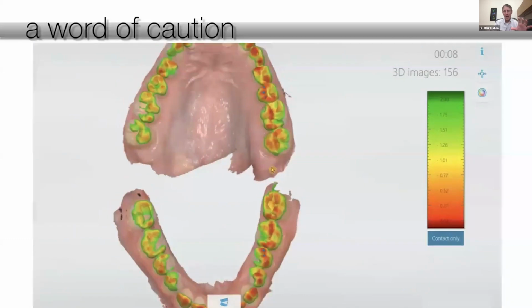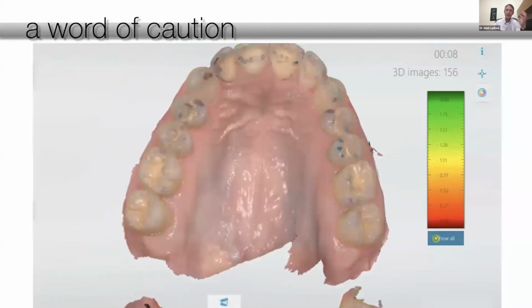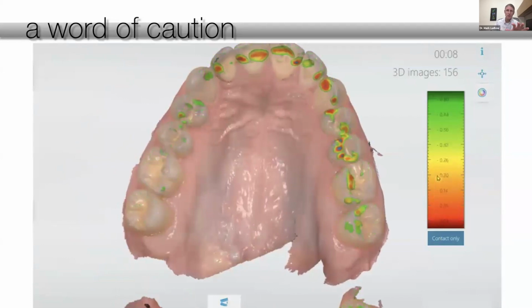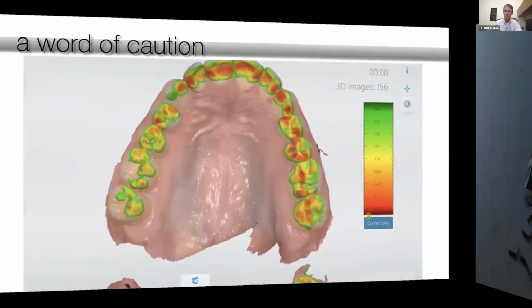And thus, if that happens, you've got to go ahead and delete out the bite, start back over, get a new bite, rescan it, etc. But again, that's why I love having all these articulation marks on there from the paper so that I can make sure that everything is lining up and getting right where we want it to go.